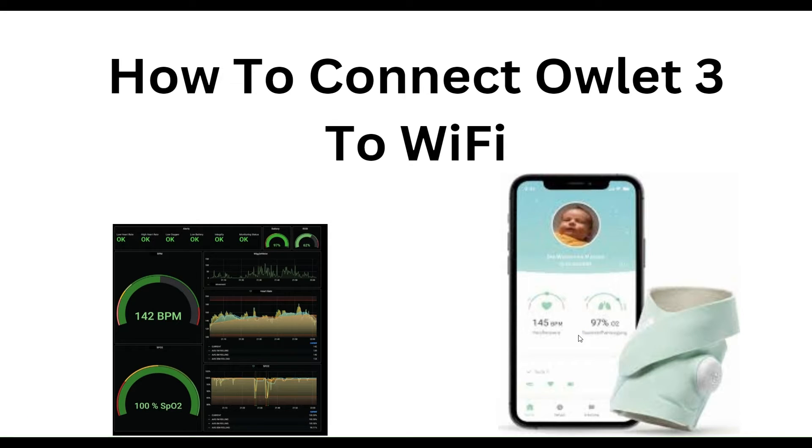Hello everyone, welcome to our YouTube channel. In this video, we will guide you through the process of how to connect Owlet 3 to Wi-Fi. We are going to discuss each step.